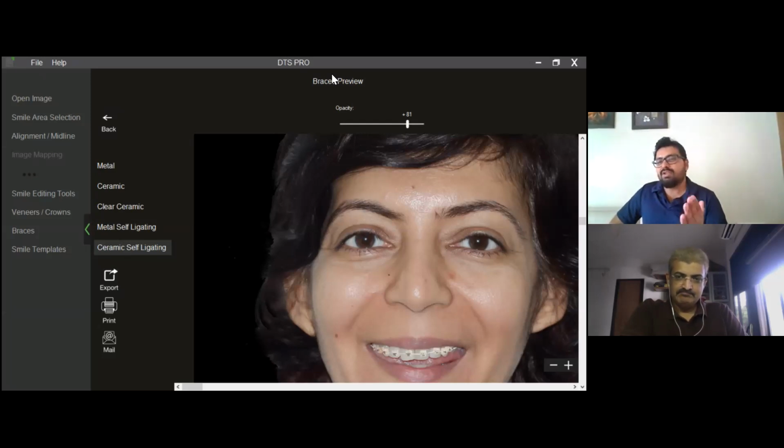And then eventually, once you are there on the 3D platform, building surgical guides, crown lengthening templates, and then eventually aligners is the way any software takes.